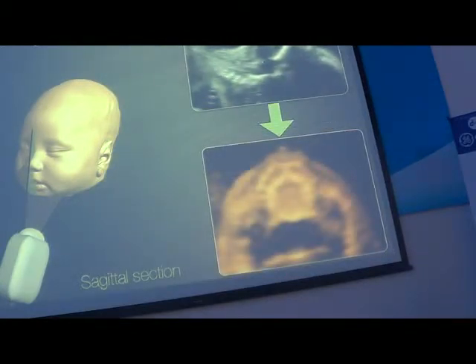And from here, you can obtain this kind of view of the complete hard palate.